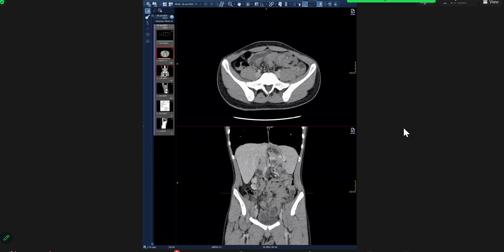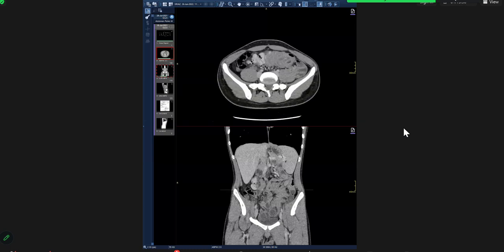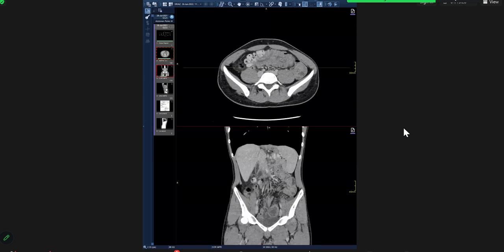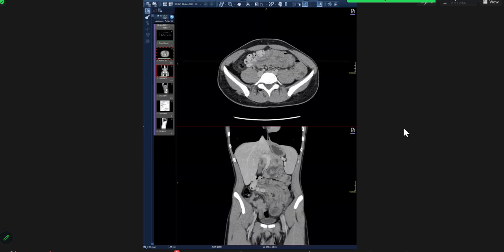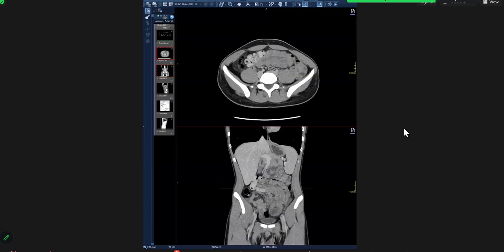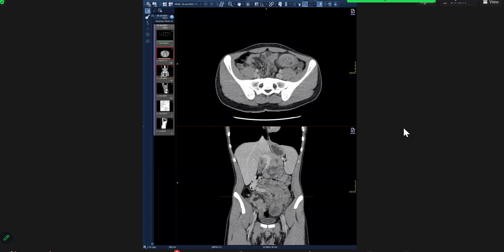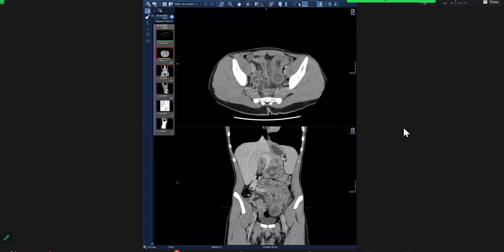Can you scroll again? I'm just seeing the whirling of the vessels. Okay, so you have to look in the rest of the abdomen too, right? Yes. Appendix looks normal. There's no whirling of the vessels, and I think it's a blind-ending structure going from the right abdomen into the left side. Okay, it could be.